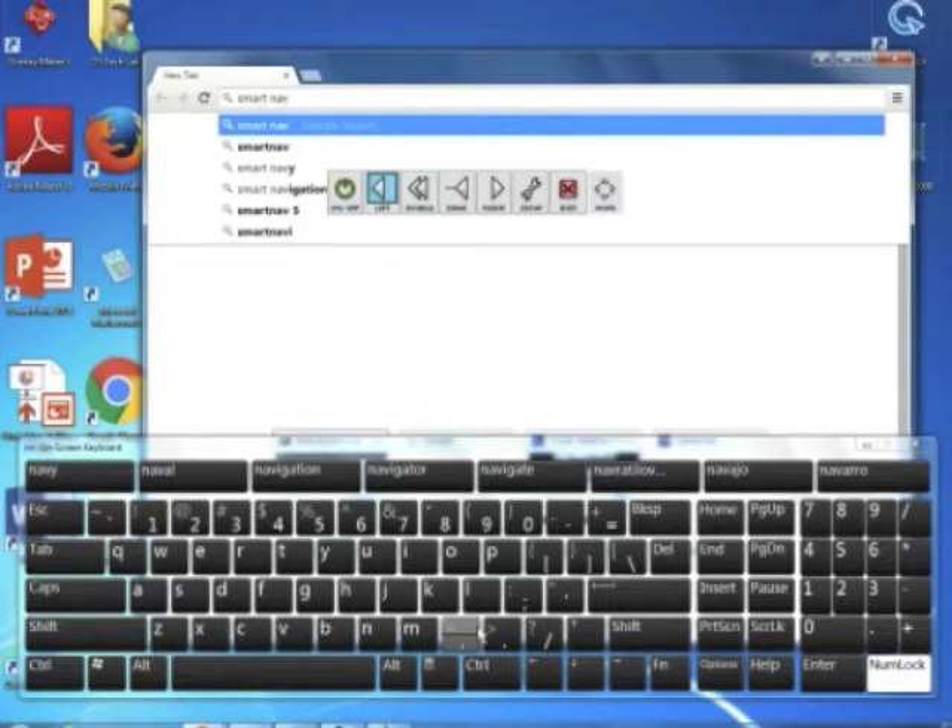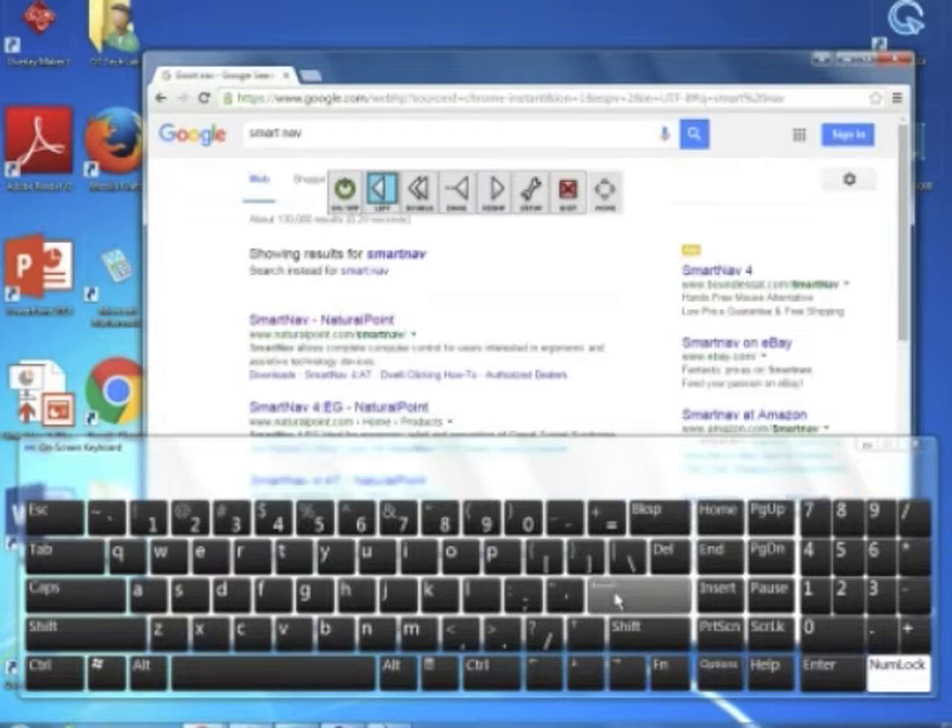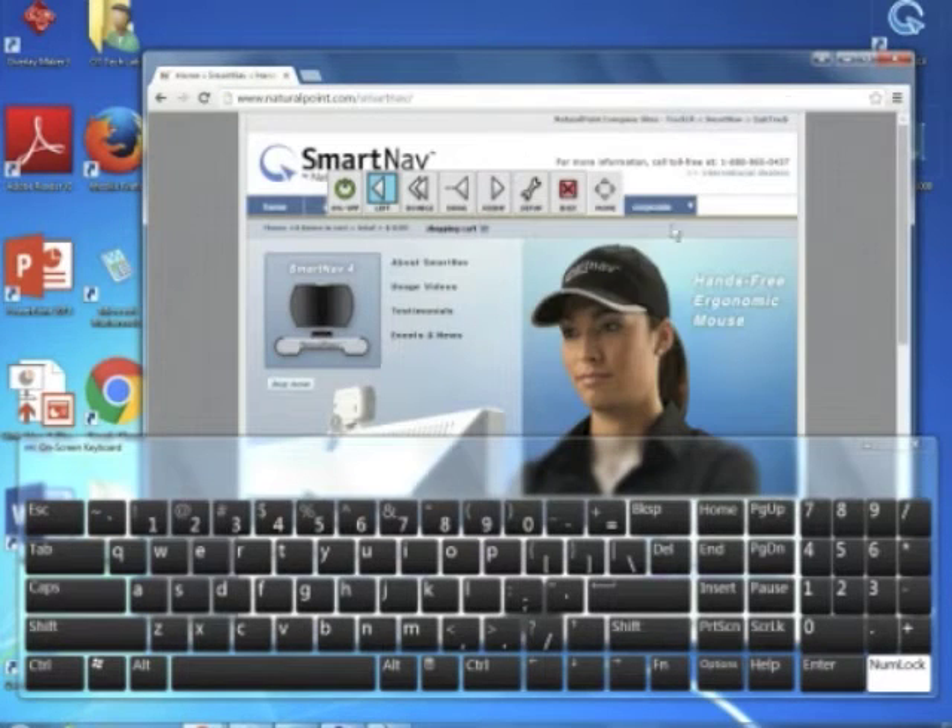Some people like to use the word prediction or scanning options available on the on-screen keyboard, but you can also type out each individual letter.